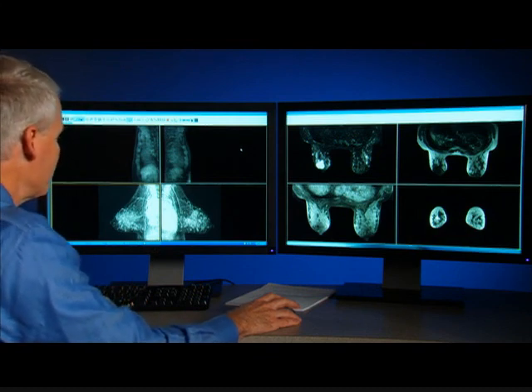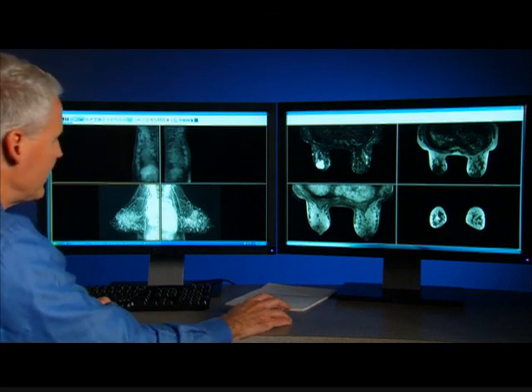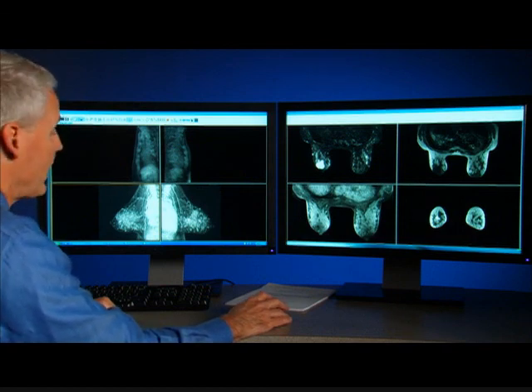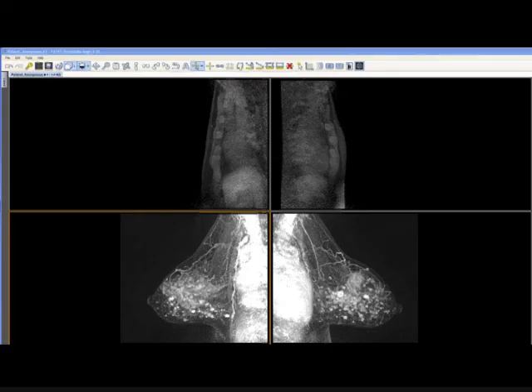I thought it only fair, though, to show the real world, and sometimes when you're faced with a case like this, when we look at your 1-minute subtraction MIP, again, the value of getting an overview, but this is going to be a difficult case.